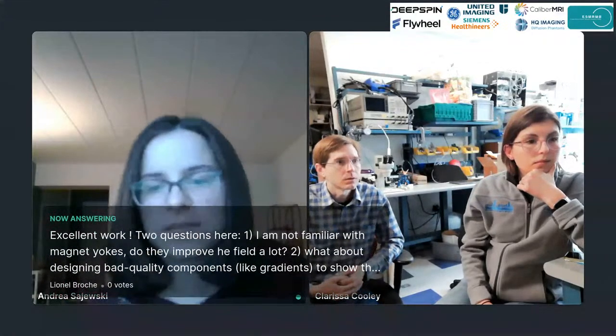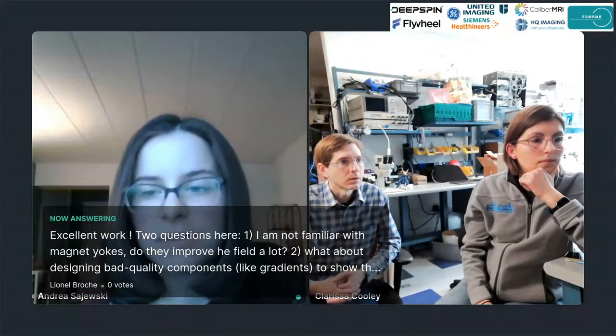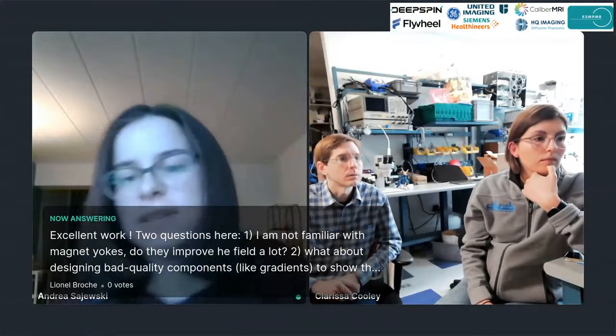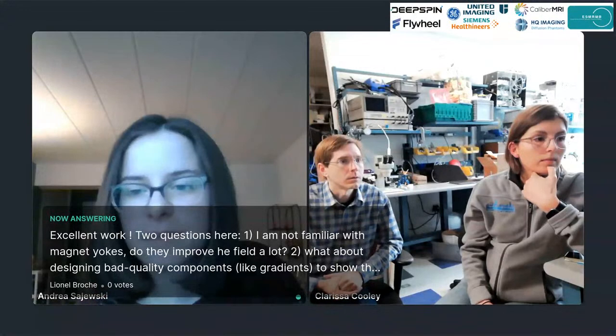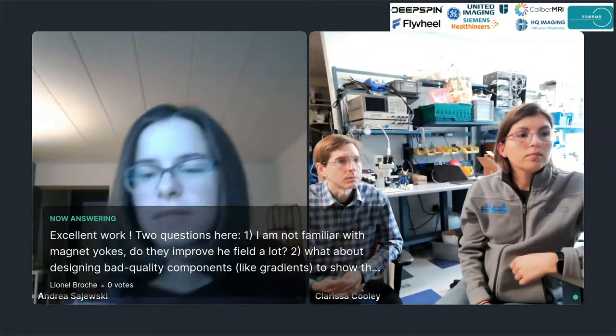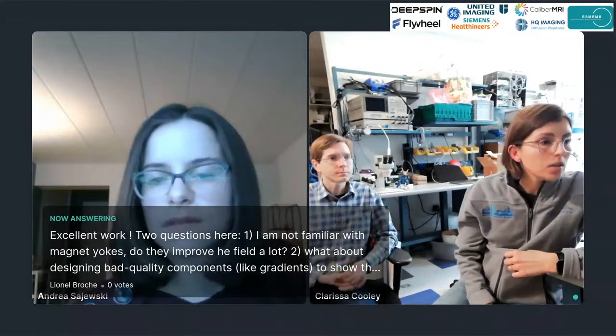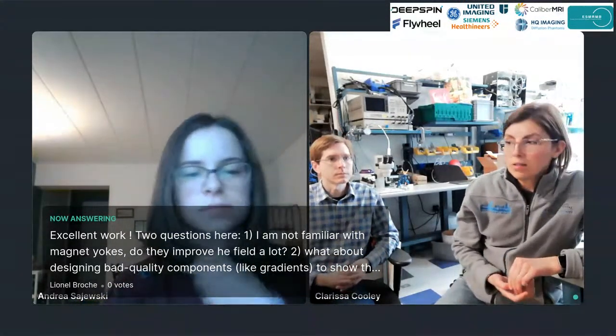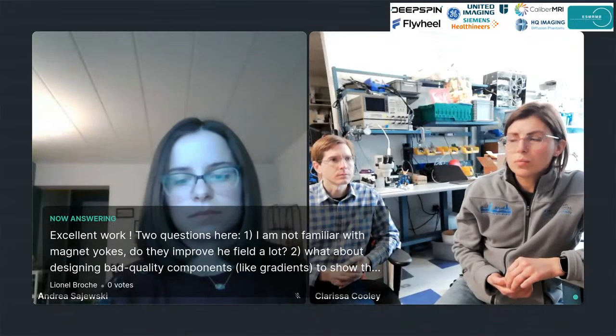All right, looks like we have a couple of questions. First, Lionel's asking about the magnet yokes. Do they improve the field a lot? Yes, the yokes do improve the field.